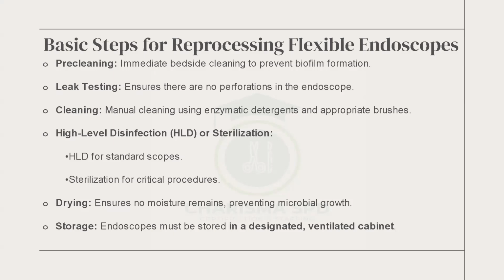Then once it is done, you have to dry. If it is HLD, which is high level disinfection, you have to hang the scope for the scope to dry. It must not have moisture or liquid in it to go to be used on the next patient. All right. If it is sterilized, you're good. You don't have any problem with that. And then it might be stored. If it is high level disinfected, it must be stored in the appropriate cabinet or appropriate housing mechanism so that it is safe, it is protected, it is not exposed to the outside environment where it will get contaminated. Next slide.